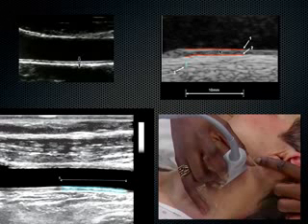So you just measure from this wall down to this wall, and you would drop a caliper right along here, and that distance hopefully is small. Around 0.6 or even smaller for the young models that we'll be using this on this week. But if you took it to a patient who was much older or had a lot of known coronary heart disease, you could see this thicken quite a bit actually. So something to think about, this carotid artery measurement.